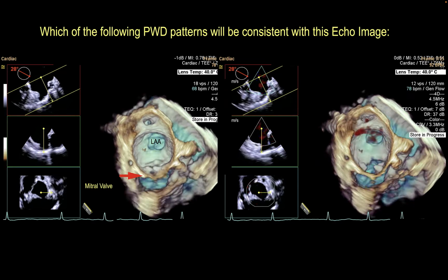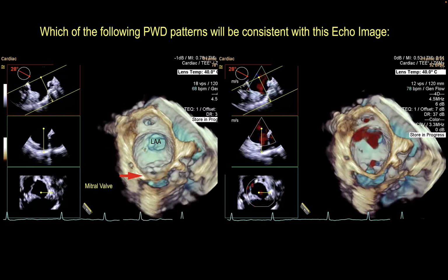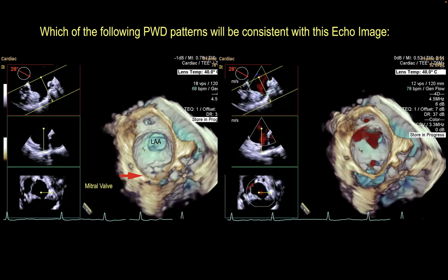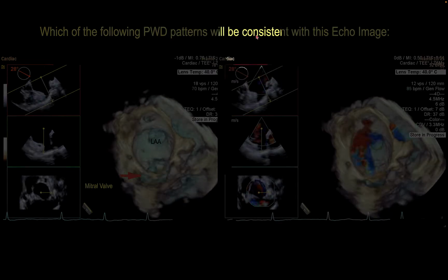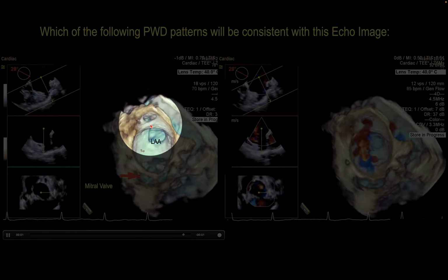So let us start with the video that was shown at the beginning of the case. And essentially the question related to the change in the pulse wave Doppler patterns based on what was being shown in this video. As you can see, this is the mitral valve. That's the left atrial appendage. This by definition is the Coumadin ridge, and this is the left upper pulmonary vein.